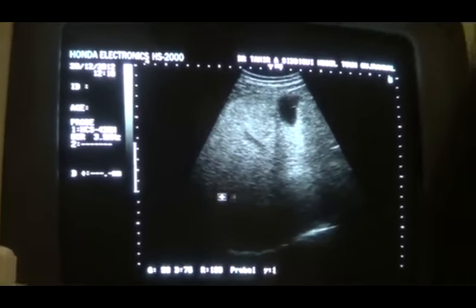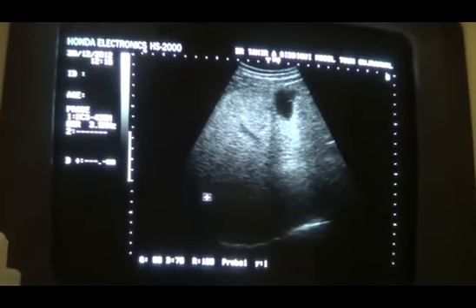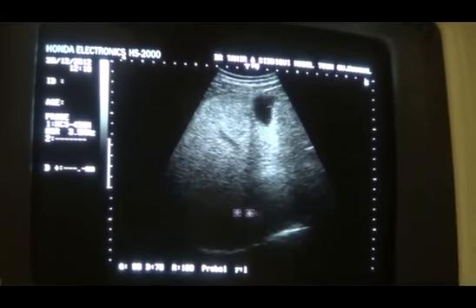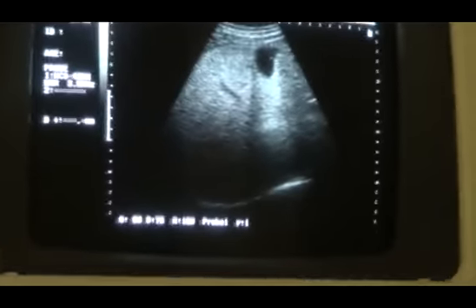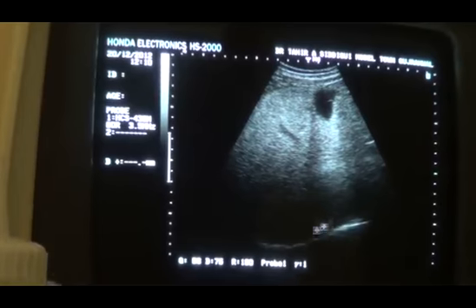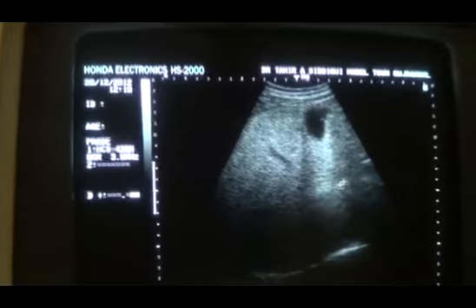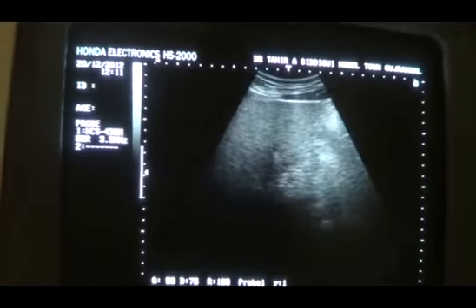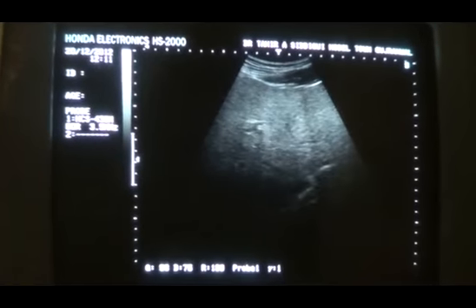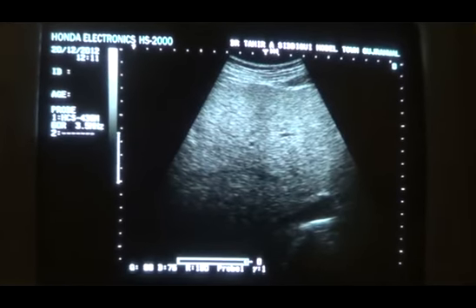This favors the fatty liver, and the more the liver is fatty, the more this area above the diaphragm will appear black to you, because the absorption of the sound waves by the fat is rapid, and by the time they reach this area, they are attenuated. And this is the gallbladder. So fatty liver, and if you see the vessel margins, they are blurred.